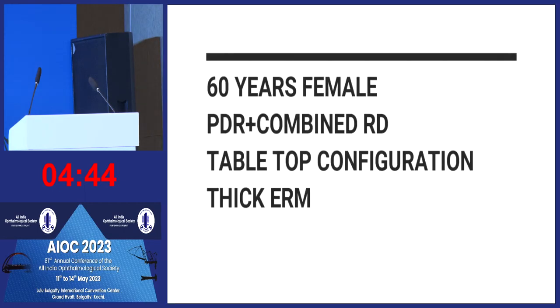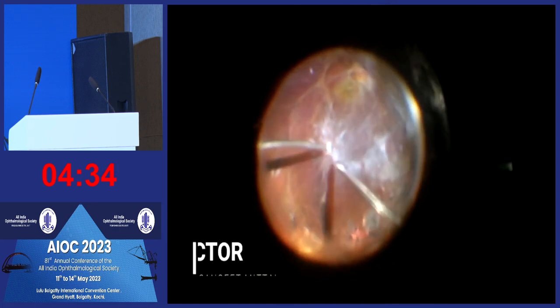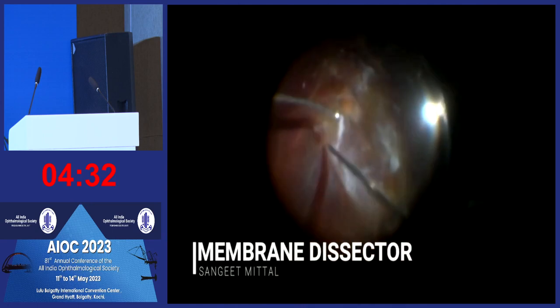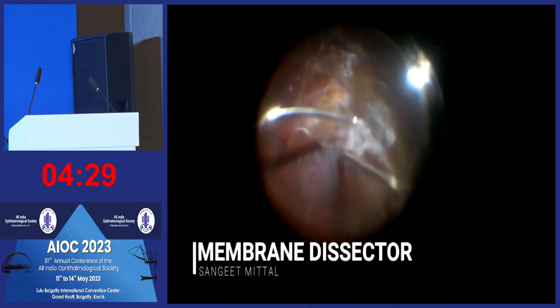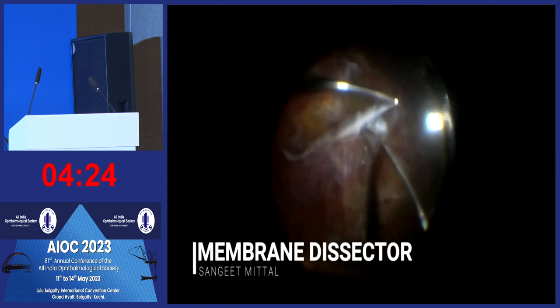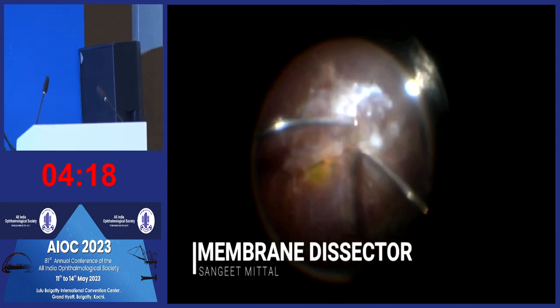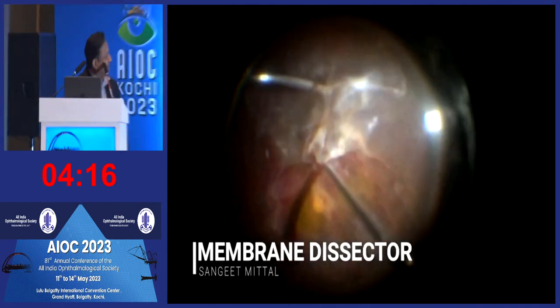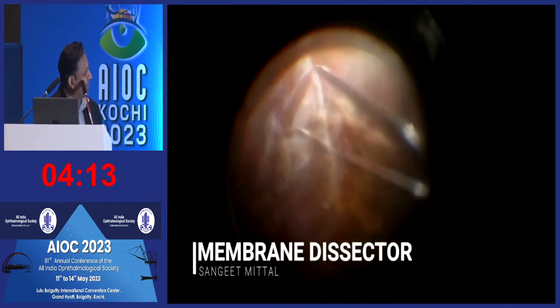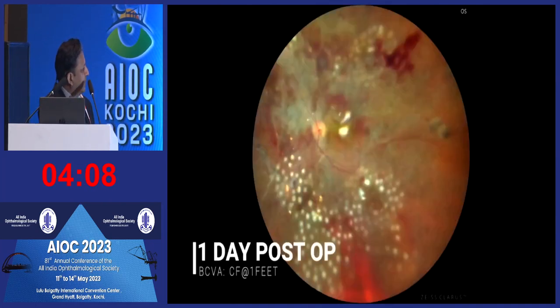Eyes of PDR with combined or tractional retinal detachments with extensive fibrovascular proliferation and tabletop configuration are most difficult to manage. Most eyes go blind despite multiple surgeries and use of latest instrumentation. In this video, we demonstrate the bimanual dissection of membranes using a newly designed instrument nicknamed Arrow. The membrane is grasped using an end-gripping forceps and Arrow is used to dissect the membrane in the manner shown in this video. The pointed tip of the arrow creates a plane of dissection. It is then moved in a to and fro motion to separate the membrane from the retina. Its sharp lateral edges help to cut through the vascular epicenters present in the membrane.